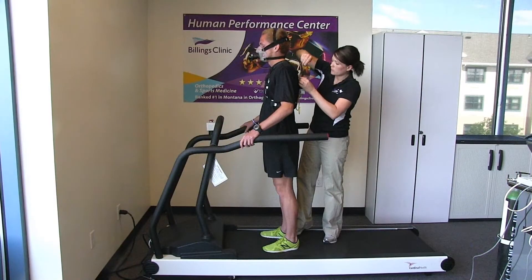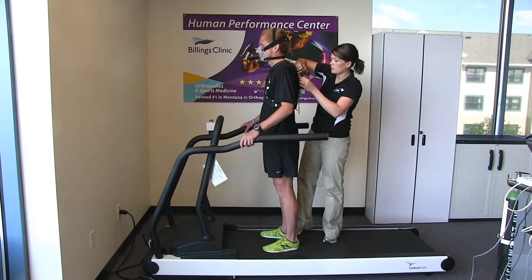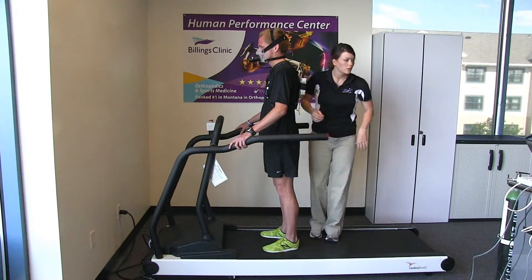For blood lactate testing, we actually take a blood sample with a finger prick — it's just like a glucose monitor. That test is about 30 to 45 minutes long.